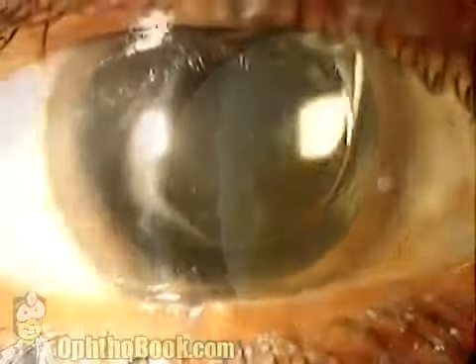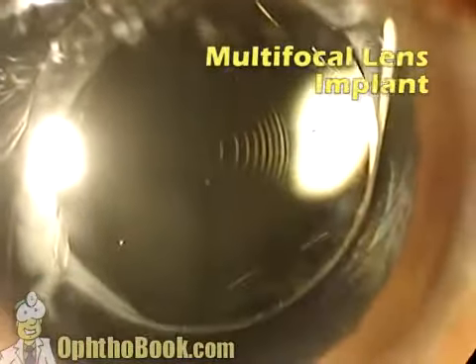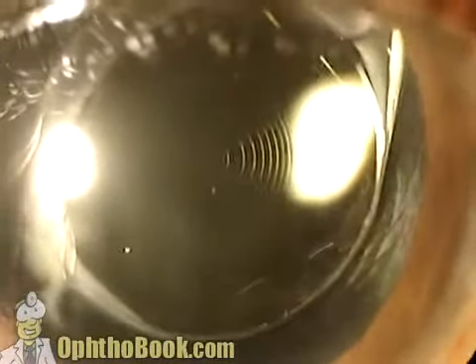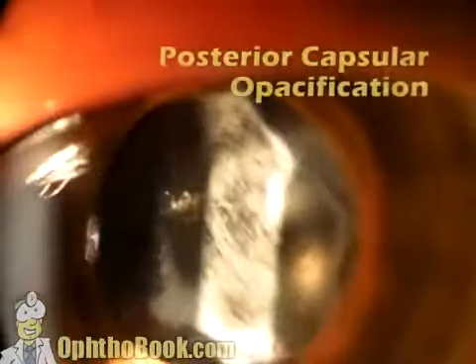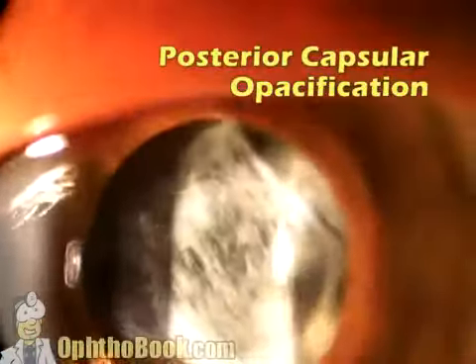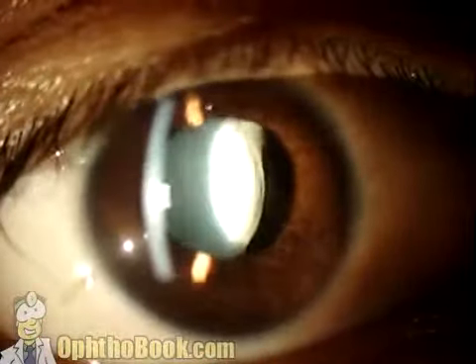case to manage. Here is an implant after a successful cataract surgery, and we know this is a multifocal implant because you can see these little concentric rings starting from the middle and moving our way out to help with distance and near vision. Here is our PCO, or after cataract. It's formed on the back of a completely normal lens. Very easy to use the YAG laser to get rid of that.